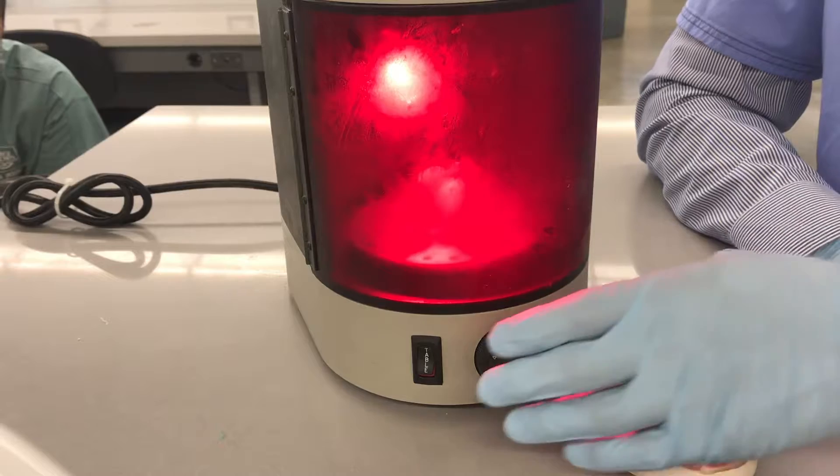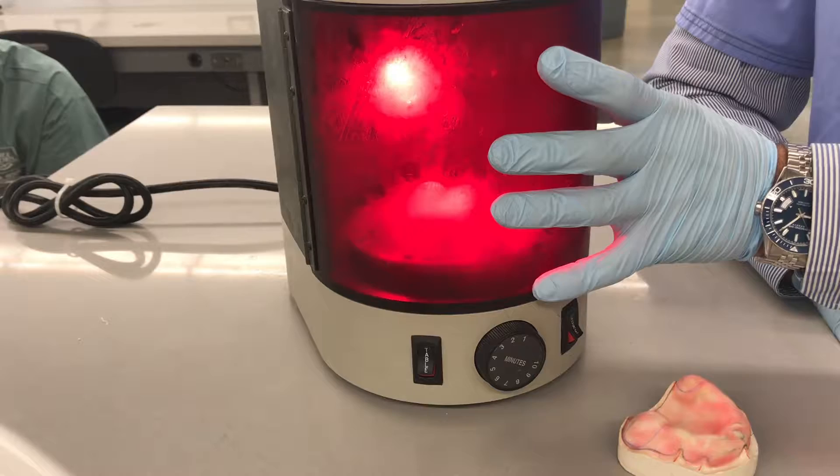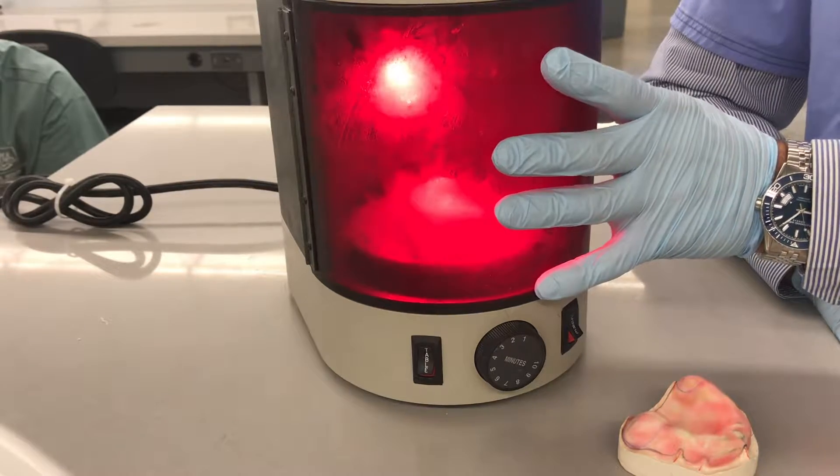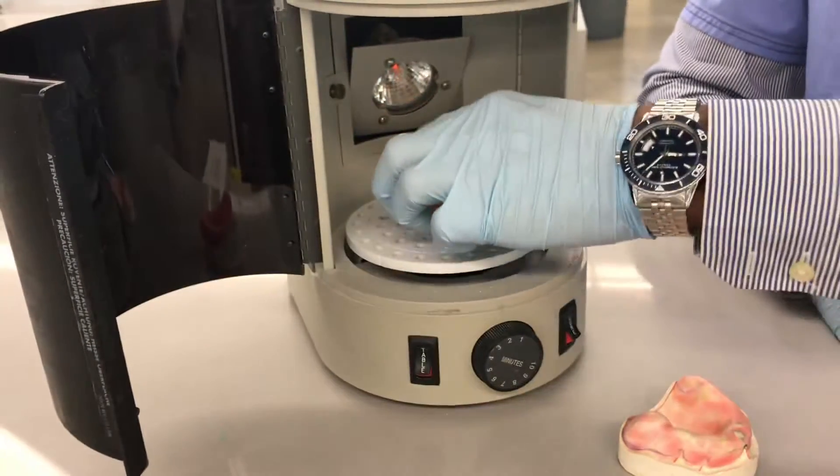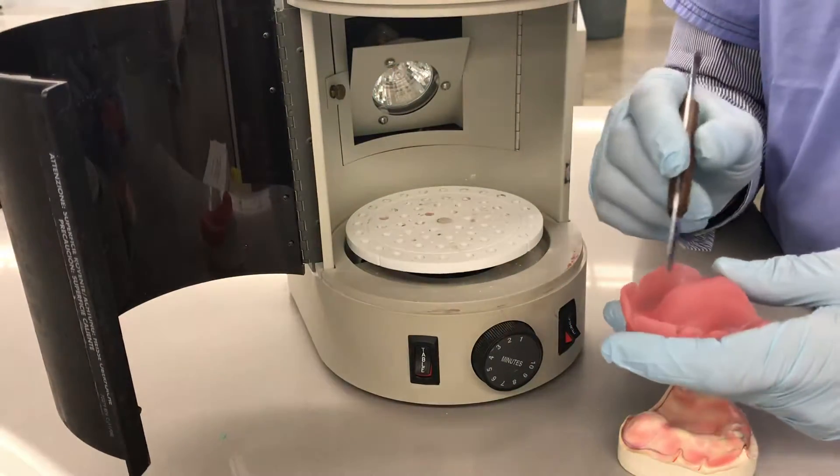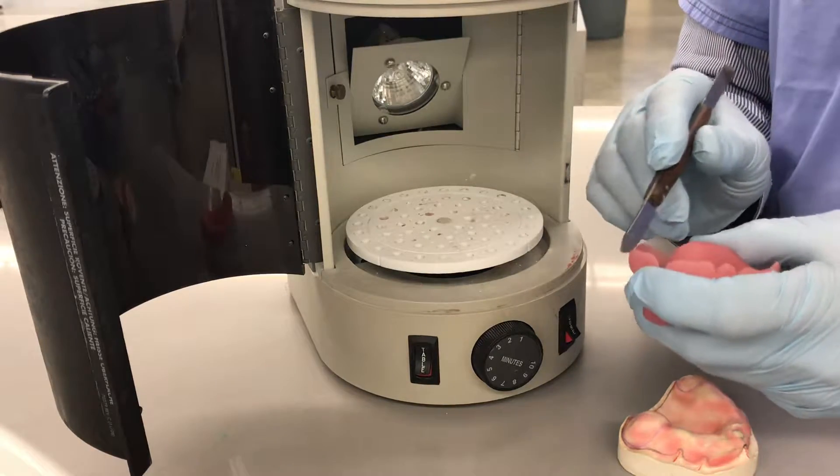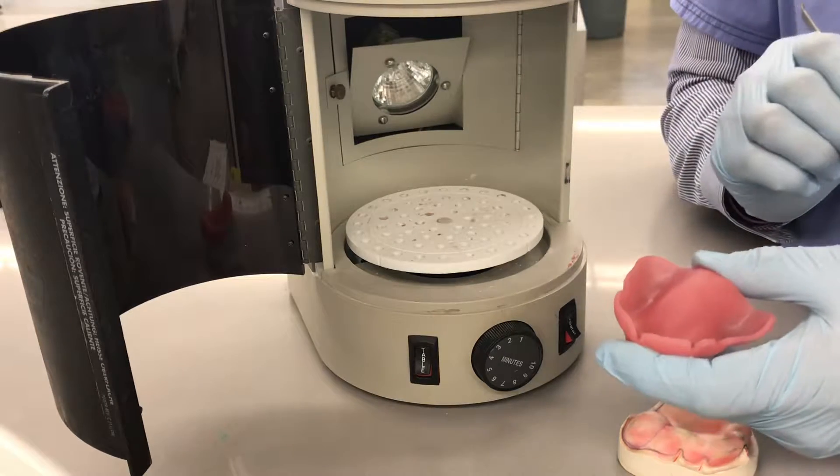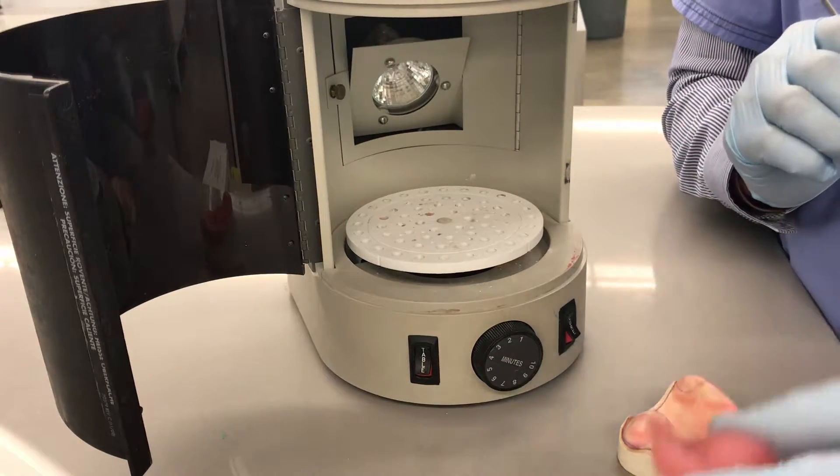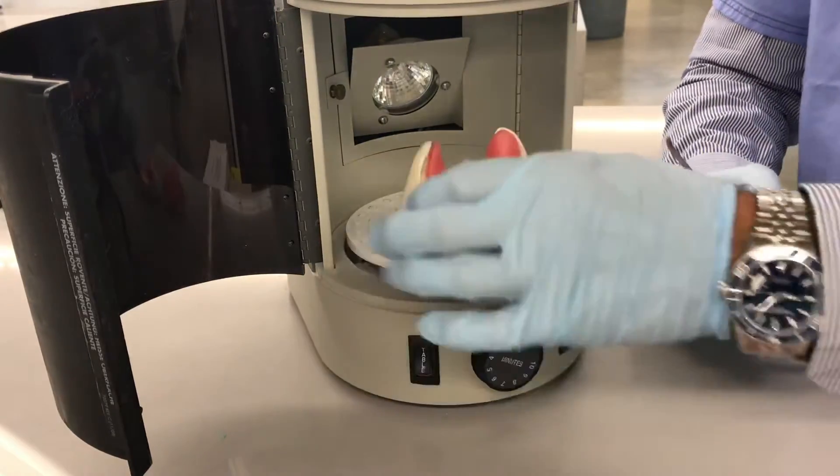So even though my timer's at three minutes, I can interrupt this timer any time I want. So that's about 30 seconds. I'm going to take this out and give it a final inspection. Make sure that all the peripheries are thoroughly cured throughout. And that looks pretty good. So I'm going to set the upper one aside and bring the lower one in.